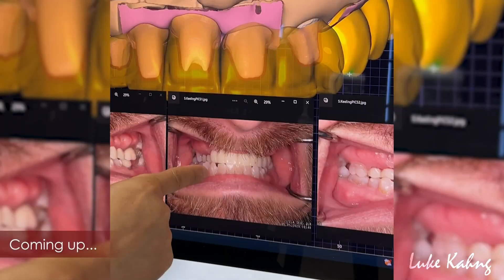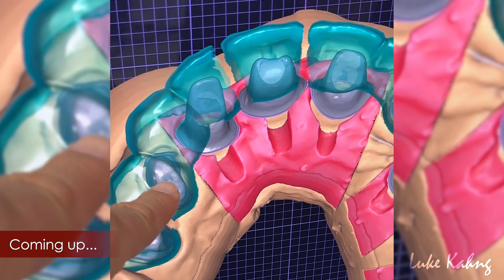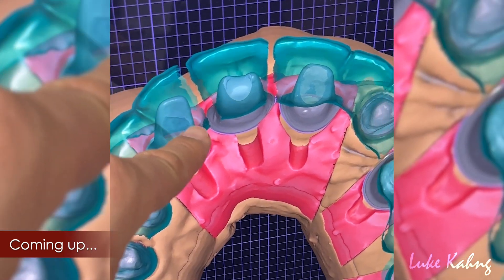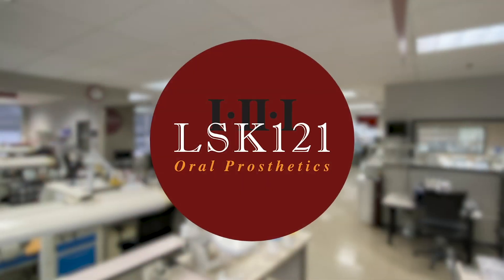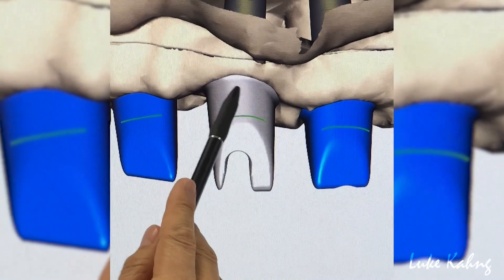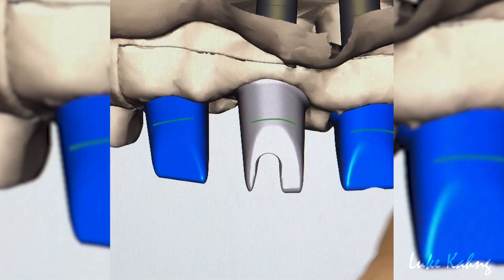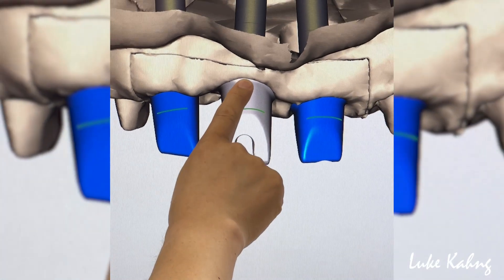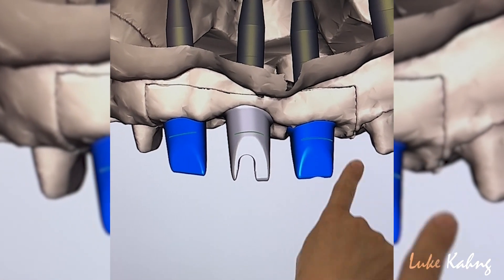After we made the intensive work, we scan again because the platform is too thick. I have to create the facial. So unfortunately I have to make a 3-unit bridge. This is Atlantis design. Whenever you do this, I have a problem — the aesthetics problem. This is higher, this is short, so my restoration will be really ugly.